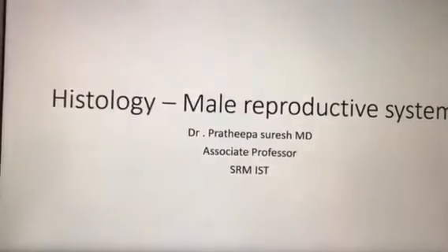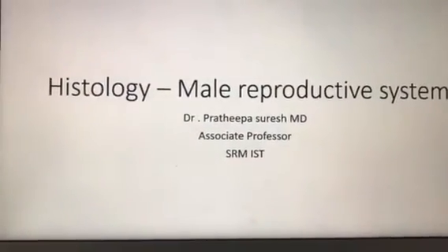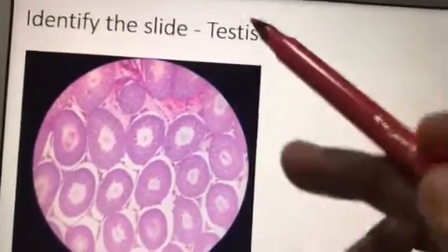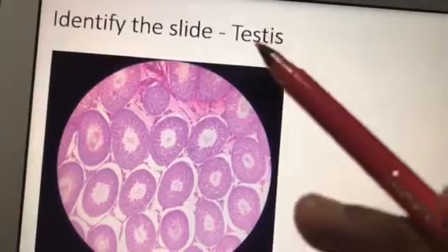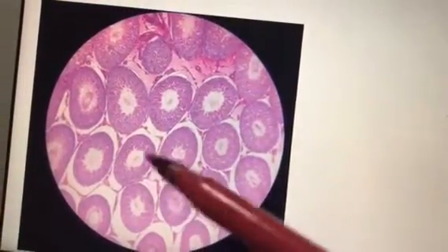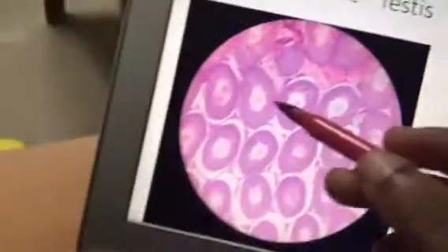We are going to see a short brief revision of the male reproductive system. Identify the slide — the answer is testes. Here you can see a lot of tubules, round circular structures. These are long convoluted tubules; when you take a cross-section, they appear as rounded structures.